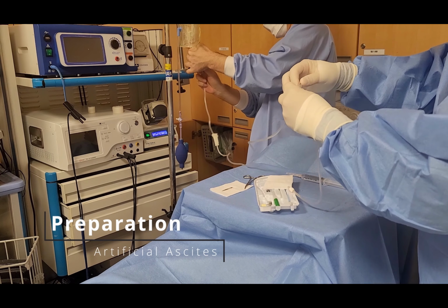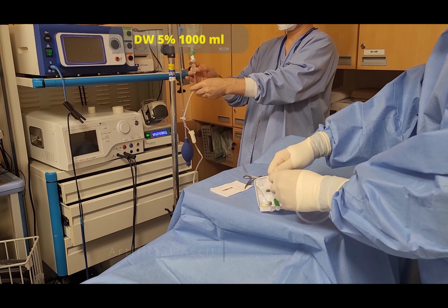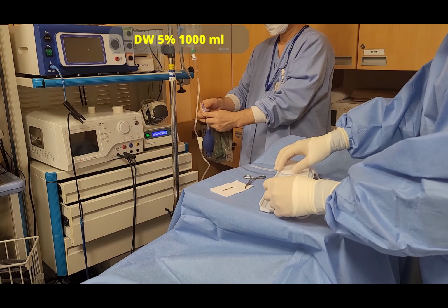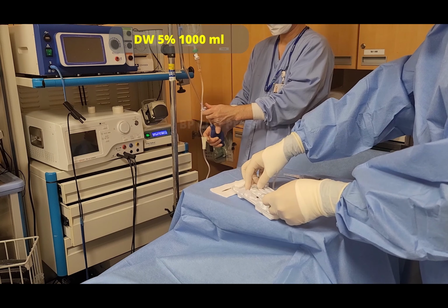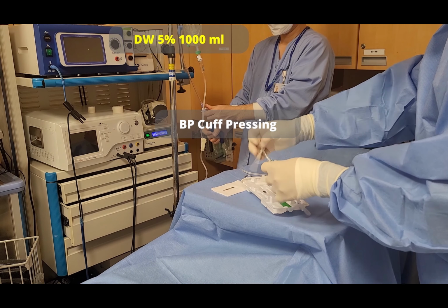We use a 5 French angiography sheath rather than a spinal needle. Many operators just use a spinal needle, but I strongly recommend the angiography introducer sheath, which has much benefit compared to the needle type.